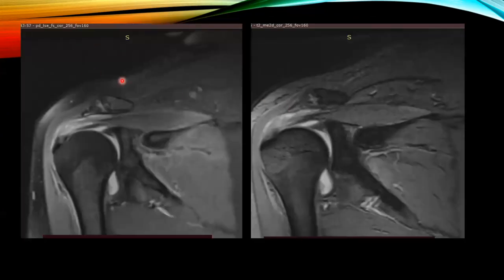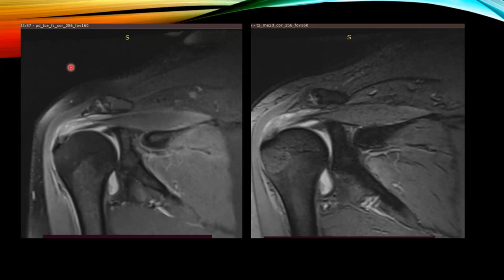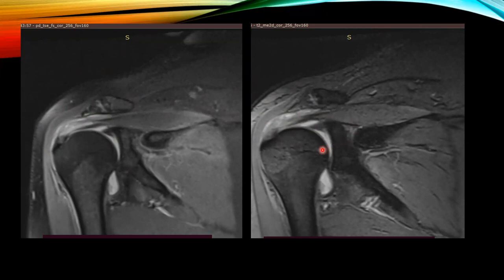These are cases of rotator cuff tear from my study. In this proton density weighted image, hyperintensities are noted within the infraspinatus and supraspinatus tendons, with increased bulk in the tendon near its insertion along with extensive peritendinus fluid and secondary degenerative changes appearing hyperintense on both T2 and proton density images.